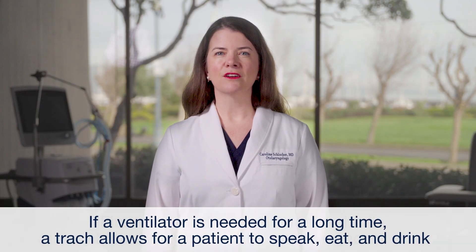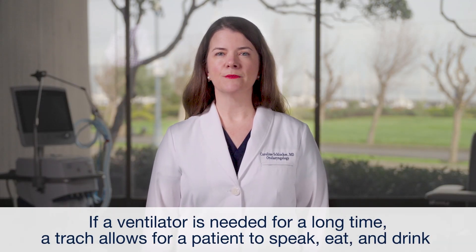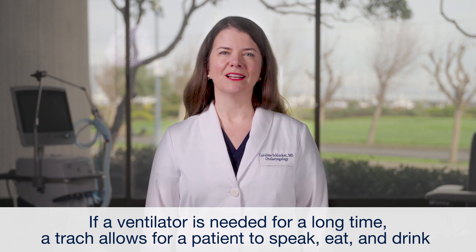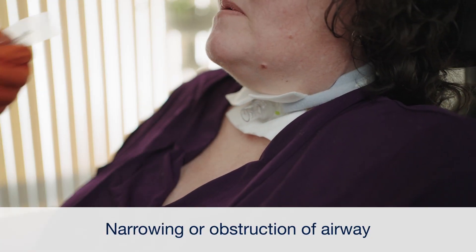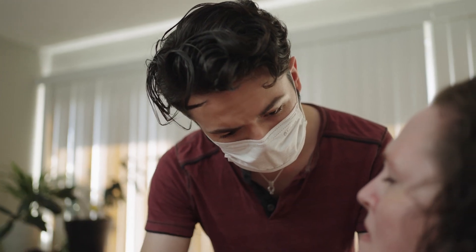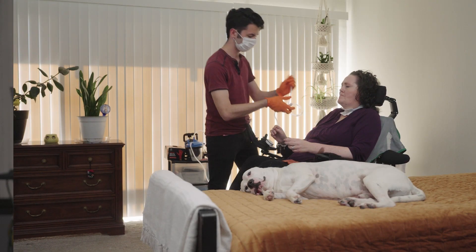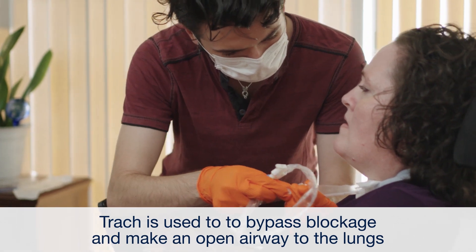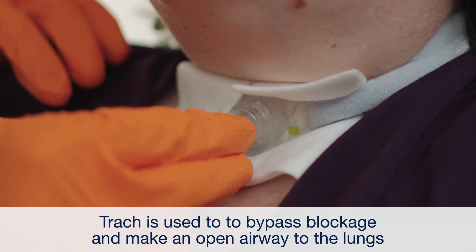If a ventilator is needed for a long time, a tracheostomy allows for a patient to speak, eat, and drink while still using the ventilator. Some patients need a trach due to the narrowing or obstruction of their airway. There are many possible causes of an obstruction, but the purpose of the trach is the same — to bypass that blockage and make an open airway that allows air to pass into and out of the lungs.